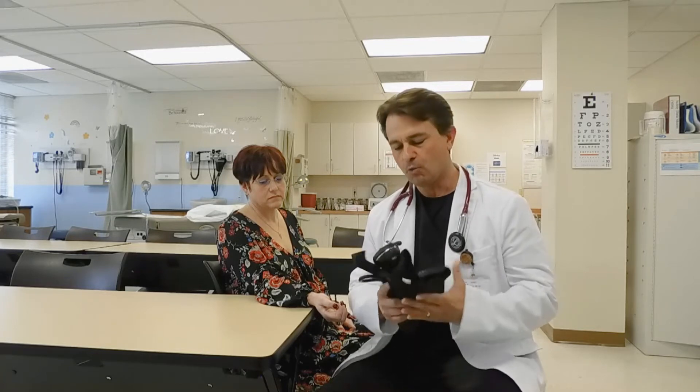To begin taking blood pressure you want to make sure first you have the proper equipment. We always need a stethoscope to hear the patient's pulse sounds and we also need a blood pressure cuff with a pressure meter attached called a sphygmomanometer. With this equipment, this is what we need to manually take blood pressure for our patient.